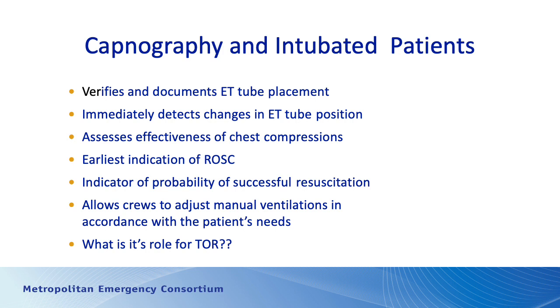So a couple comments about capnography in intubated patients. We use it to verify and document endotracheal tube placement. So if you place an artificial airway, make sure that you obtain a capnography and document the value. You can either put that in the record under vital signs, or upload the monitor information from your cardiac monitor into your EPCR. Either way, if you place an endotracheal tube, there's an expectation that capnography is started and values are documented.